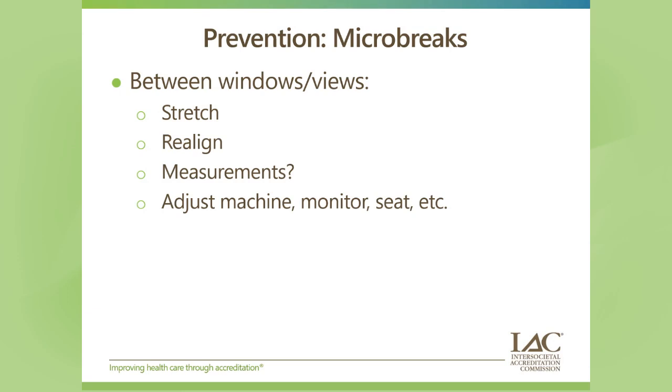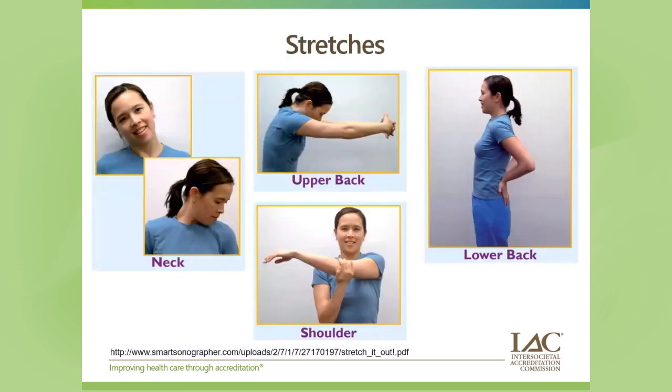I think with COVID, we've all been a little bit more aware of this and are thinking about doing our measurements after the fact, so we're not having that touch point on the patient and minimizing that actual time per hand on the probe and doing our measurements after the fact. So thinking about making those adjustments and giving yourself those micro breaks.